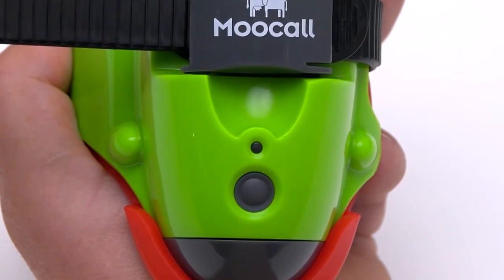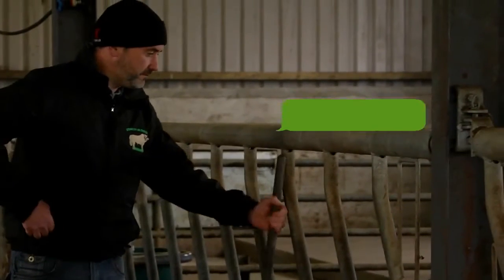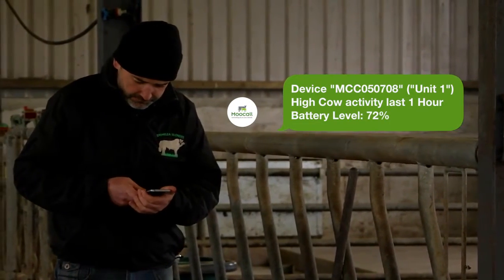When calving is imminent, the light indicator on the sensor will go to red and an SMS will be sent to the designated phones letting you know that a calving is underway.